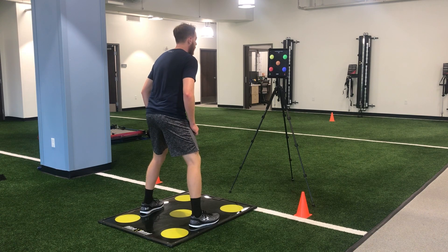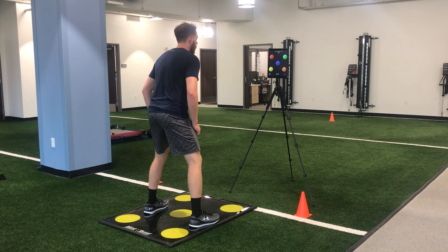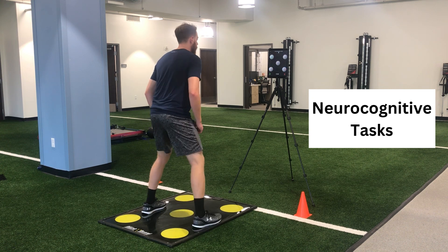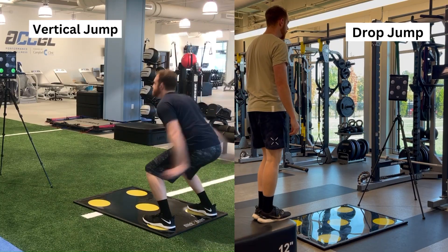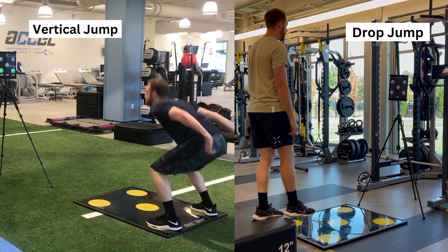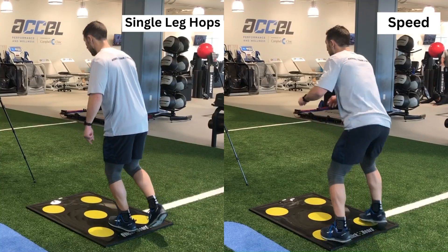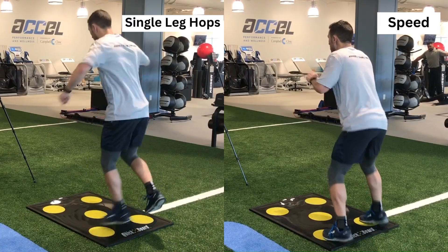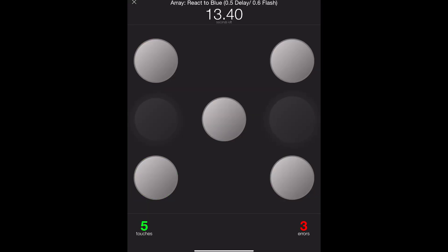QuickBoard has a vast catalog of exercises that expose and restore deficits. This includes neurocognitive tasks that target discrimination and decision-making, vertical jump and drop-jump tests, single-leg hop progressions, speed, coordination, balance, and upper extremity.